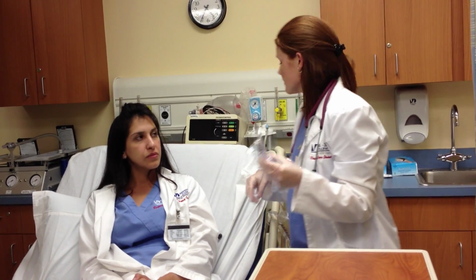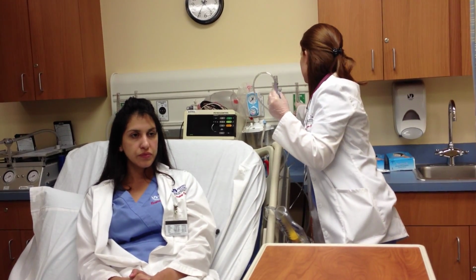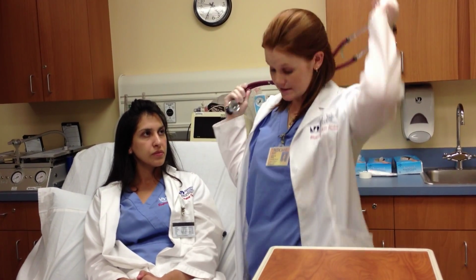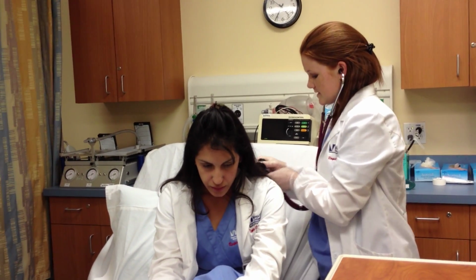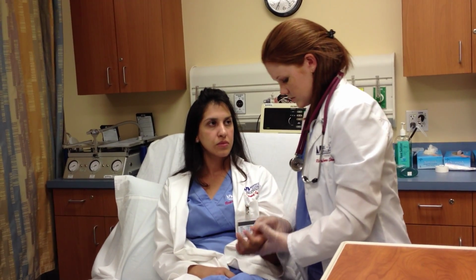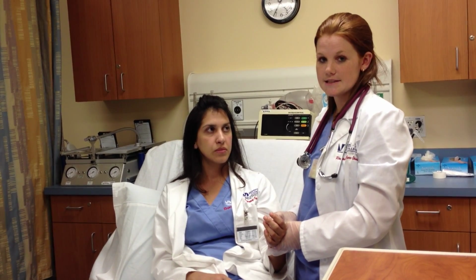After this is done, you can turn off the flow, place the equipment to the side, and do your post breath sounds and vital signs. Take a deep breath. You do your full breath sounds. Check her pulse for 60 seconds, followed by her respiratory rate for another 60 seconds.